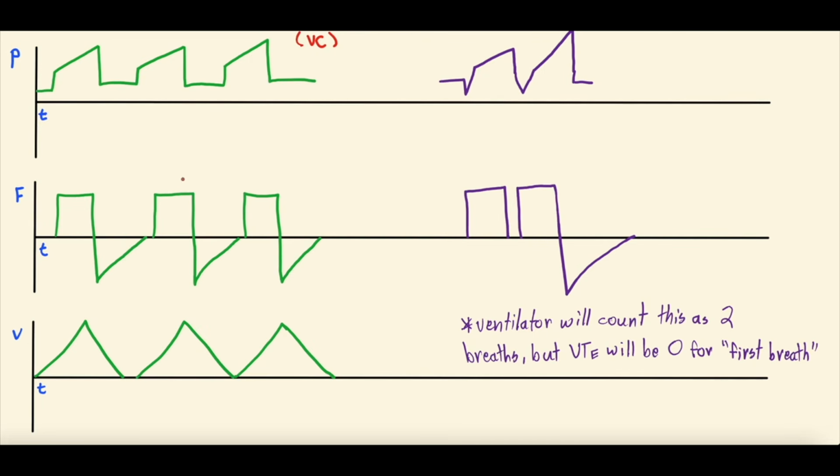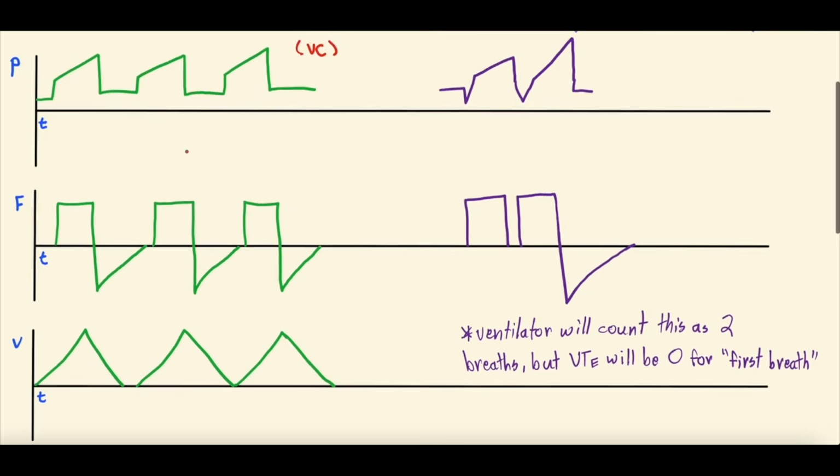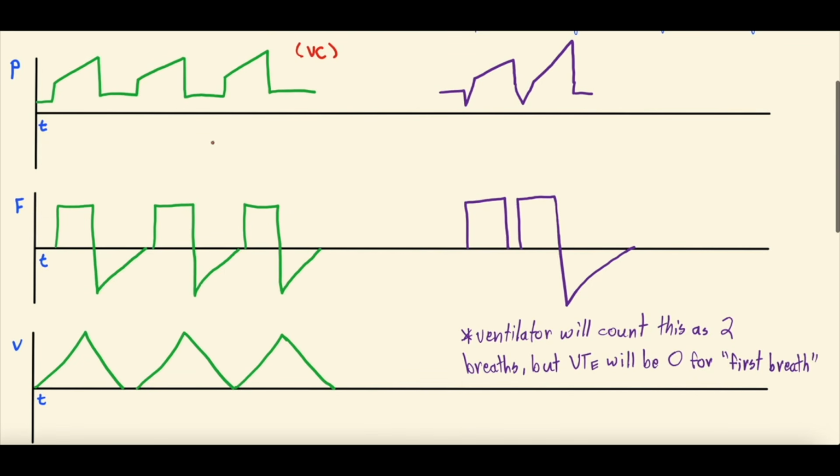If these scalars don't look familiar to you, again, check out the video we linked in the video description, which is an introduction to understanding these scalars. If they look good and you're ready to rock and roll, then you don't need to check that out, but that will be the foundation for this video. So the pressure time scalar.